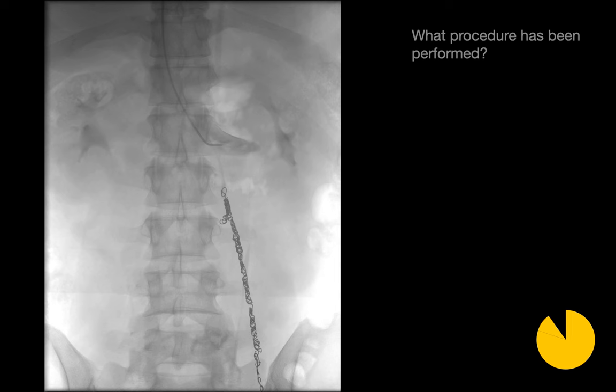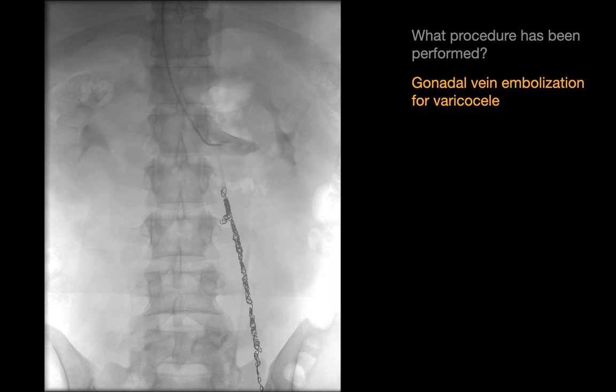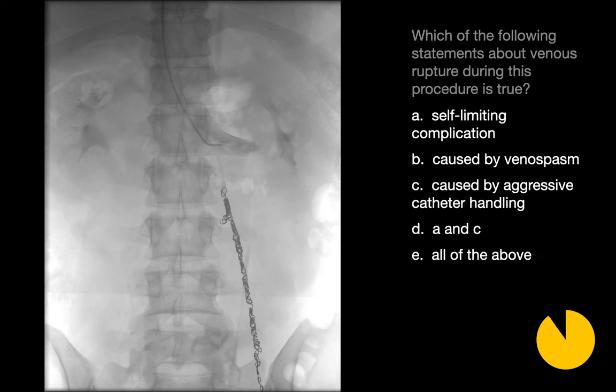So what procedure has been performed? So we're looking at images from a gonadal vein embolization for varicocele. Which of the following statements about venous rupture during this type of procedure is true? The answer here is all of the above.